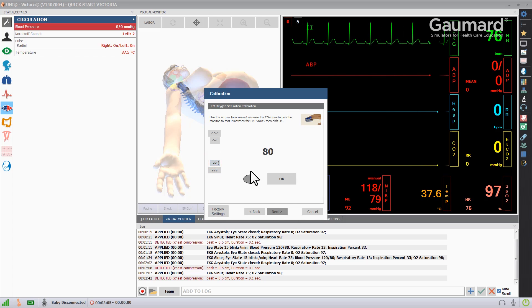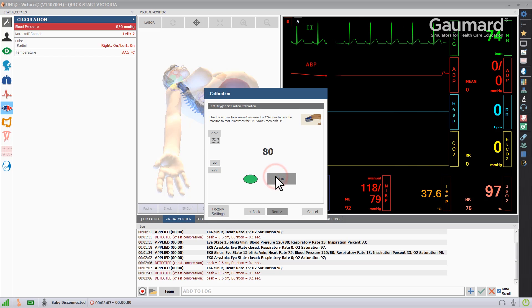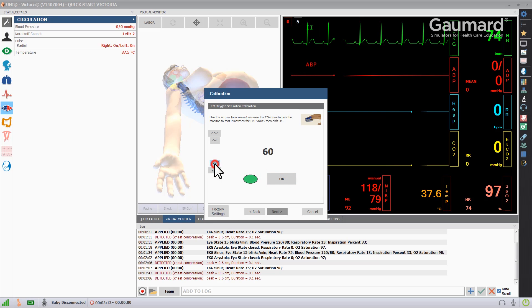Complete the process at 98, 80, and 60 to calibrate the oxygen saturation feature in Victoria's finger.